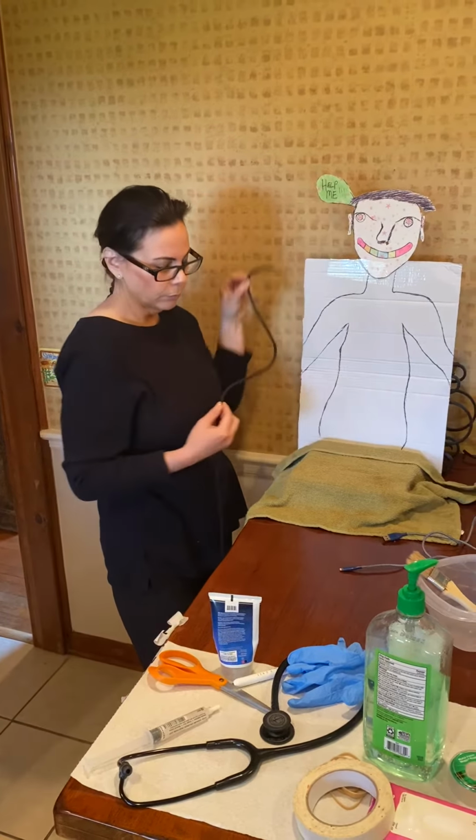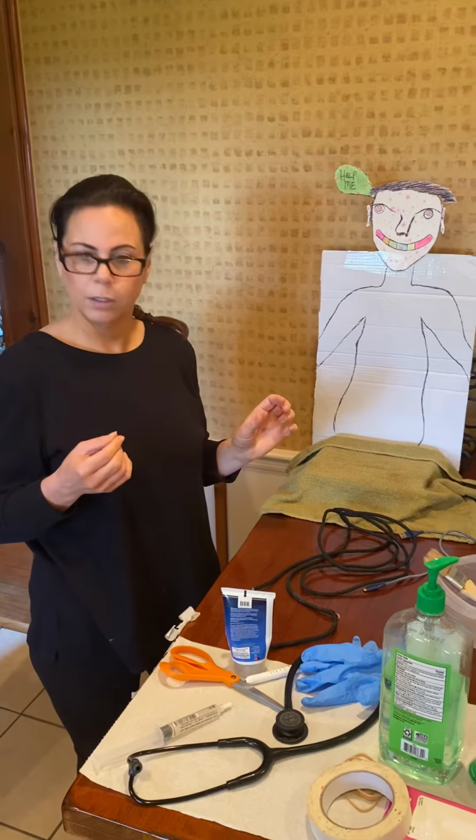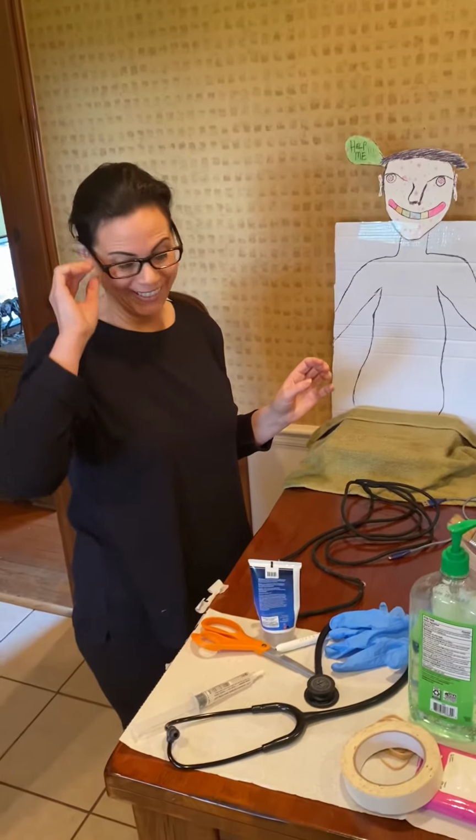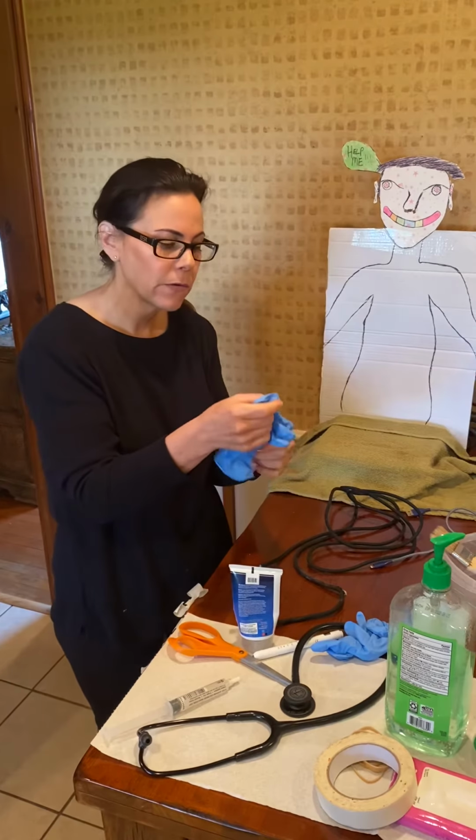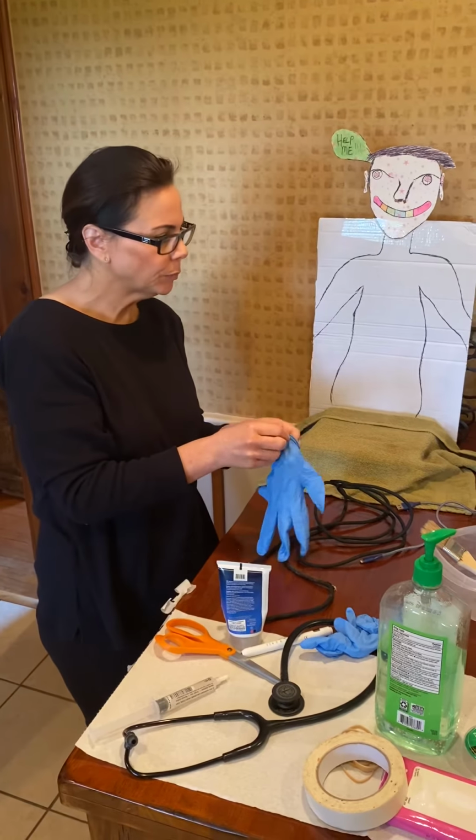Now that I've had that marked, I'm going to mark the tube at the correct length. Actually, hold on, I got that wrong. I'm going to go ahead and put on some gloves. Before I do that, I'm going to use my sanitizer, putting on my gloves.